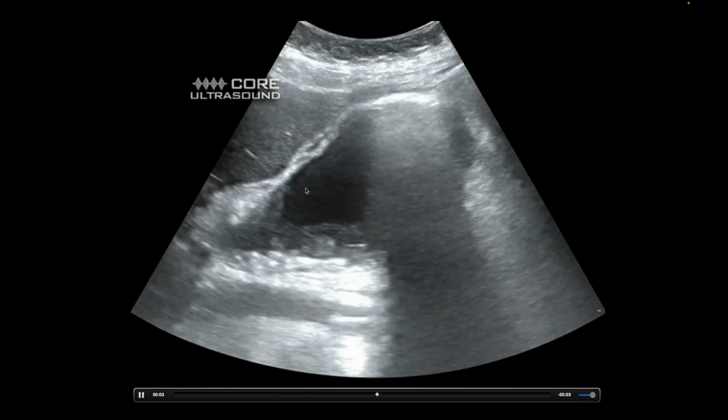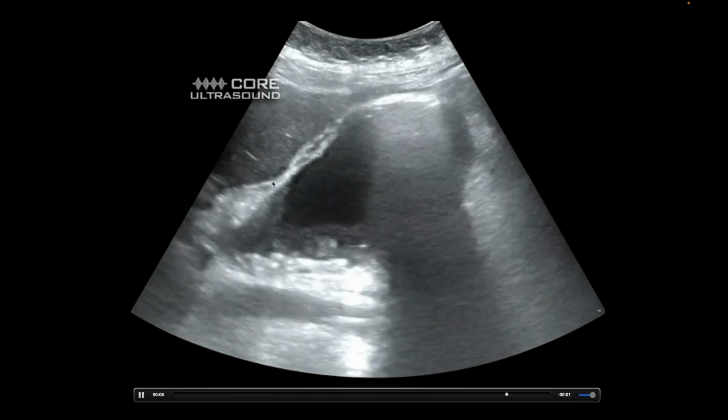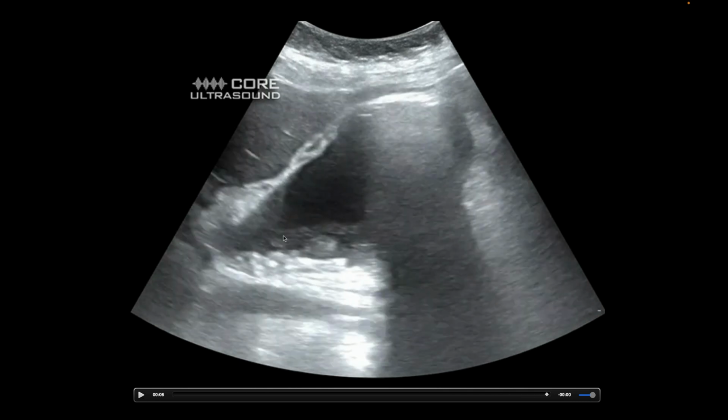So here's a gallbladder that looks a bit angry. There's some pericholecystic fluid there in the anterior wall, some sludge in the back here. But this bright white with a shadow behind it, bright white artifact here, is gas. And this is sitting closest to the probe. So this is gas that's floated up to the top of the gallbladder. Usually we would expect if there was shadowing behind a stone, it would be coming from the stone and going deep to that.